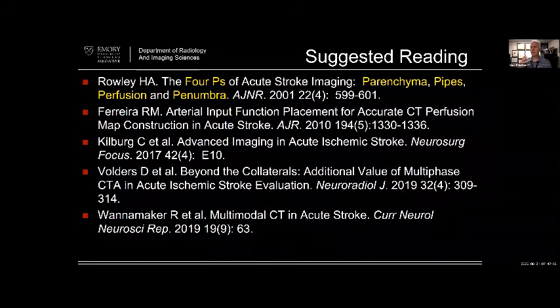The way we do our CTAs is that we have a lot of what some people would call venous contamination. So classically, you would have that part of it. Some people think that's an issue. I don't mind it. It gives me a look at the veins sometimes, and you just have to trace out arteries and veins to figure out what's there. Knowing your anatomy is good.